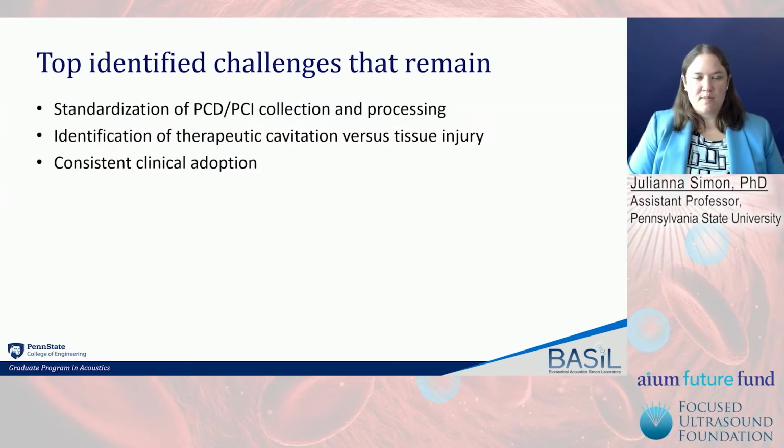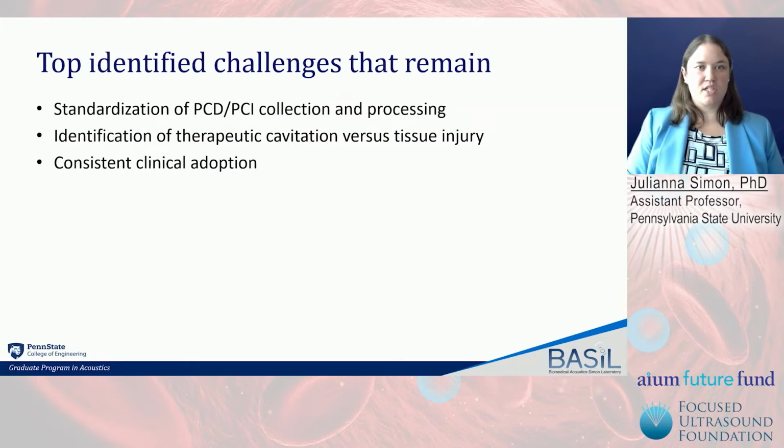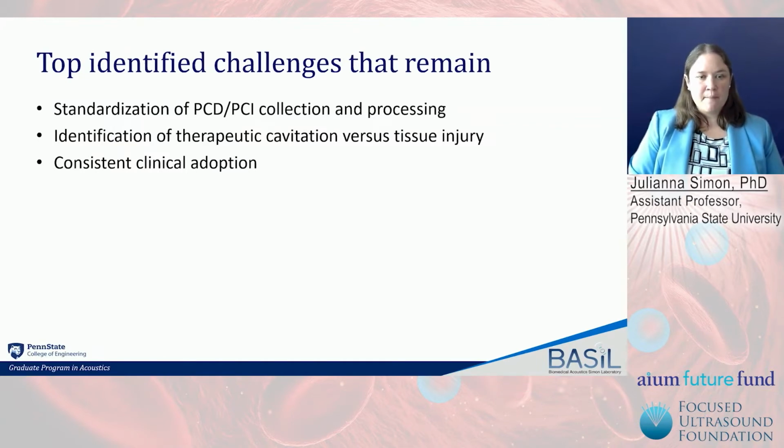In shockwave lithotripsy, there's been a lot of research showing that if we slow the shockwave rate, we can enhance fracture efficiency and reduce tissue injury. But the challenge is actually getting that into the clinic, where they're giving that buy-in. Yes, it'll take longer for the therapy, but it will be more successful. And I think similar challenges will be faced by DVT as we get sonothrombolysis more into the clinic.